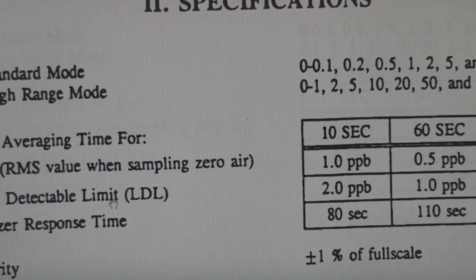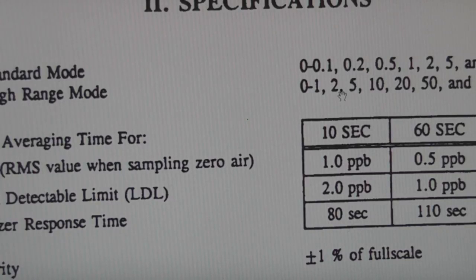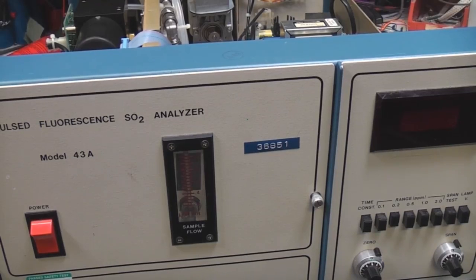The sensitivity on this is down to 0.1 parts per million, and it can average signals - over five minutes it can measure down to 0.25 parts per billion. This thing doesn't use any chemicals or anything that need replacing or filters, so I'll put it all back together and see if we can actually get some life out of it.